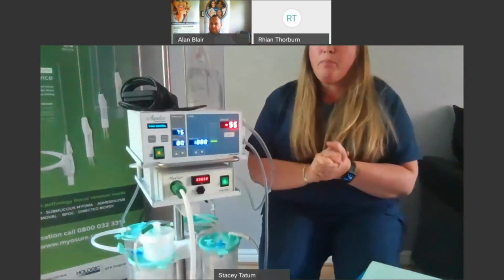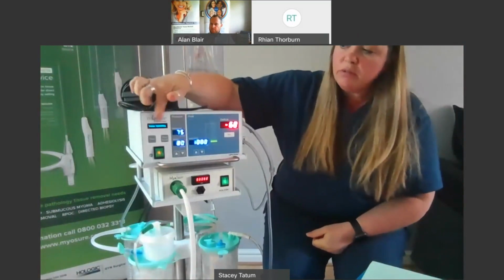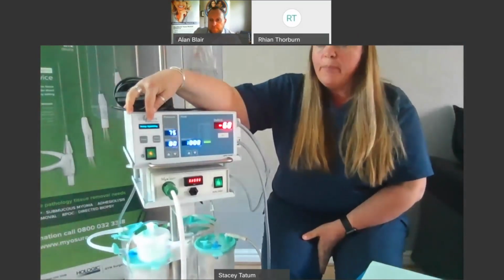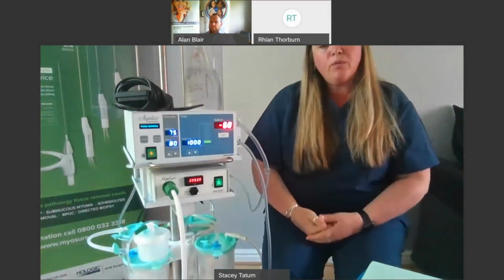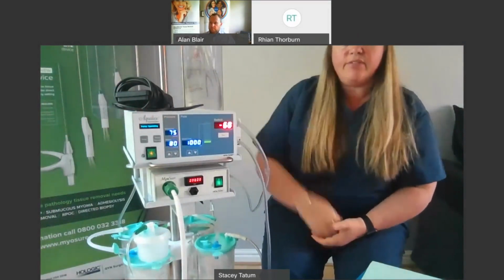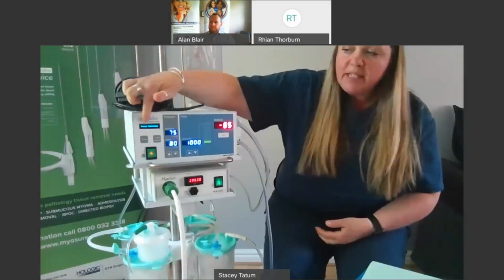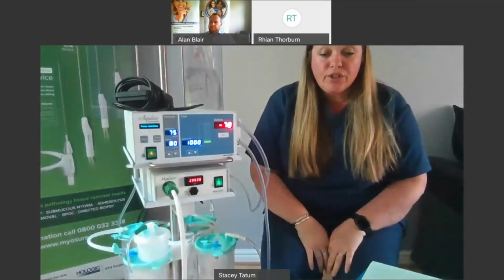So the most common message that you'll see in this window here is high fluid loss. So as we explained at the beginning, it pumps the fluid in and it pulls the fluid back and gives you an accurate deficit. But if the fluid isn't coming back, you'll see a message here that says high fluid loss, and that means there's been a gap in your suction somewhere.